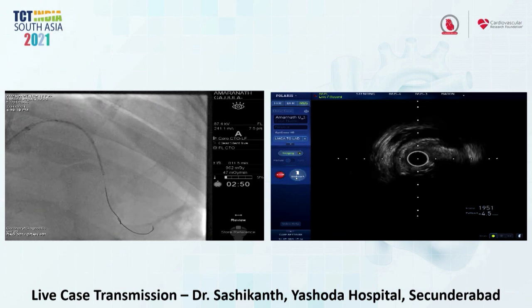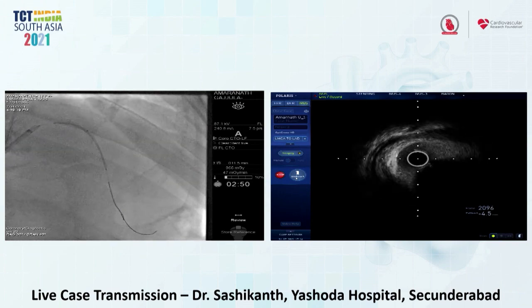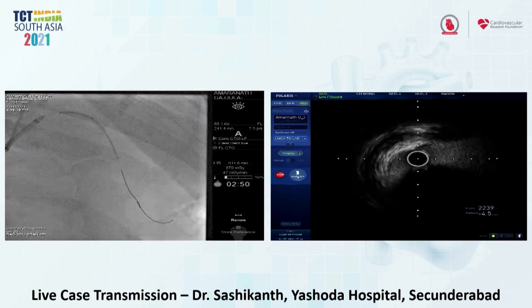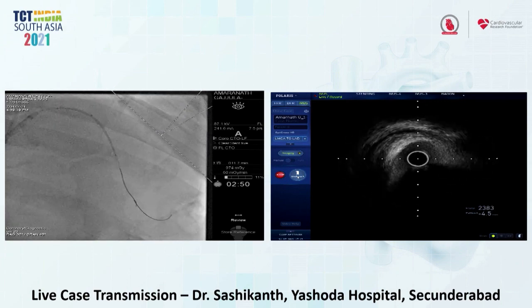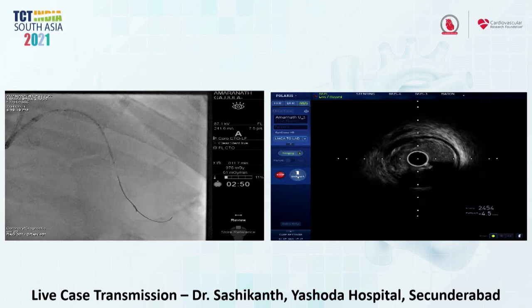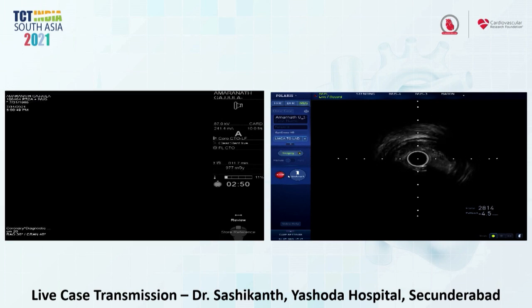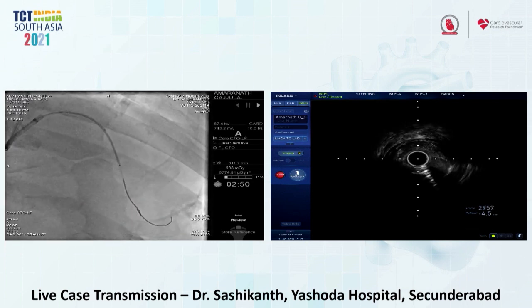Back. So, you know, it's interesting. Another way to do this without doing it 8 French and having things be done simultaneously is to mark the branches with wires. Yes. And this has been described when Ziad was at Columbia, as a sort of silhouette, the metal silhouette, marking with wires, and then going in with the IVUS, doing cines, and when you see where the IVUS is, you can then co-register it that way. And we've actually had pretty good results doing it that way as well. But it's very interesting to see this approach.